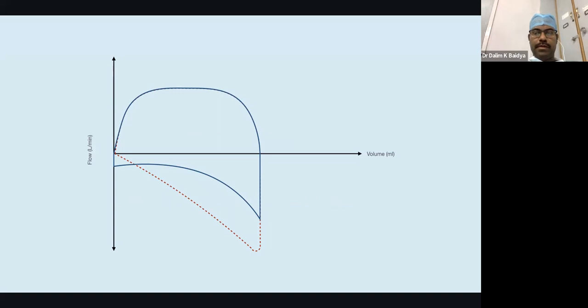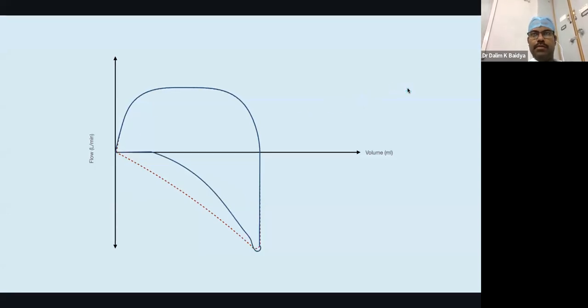Yes, very important point. And I would like to request all the students to, whenever you visit your ICUs, keep a note of the ventilator mode, which mode the patient is in, and follow up that patient longitudinally over the period of days as the patient is improving, how the ventilator mode is being changed. Like from initial control mode, volume control or pressure control mode, the patient may go into the pressure support modes, and then finally the spontaneous breathing trials.